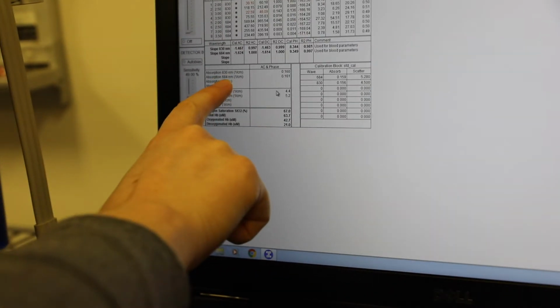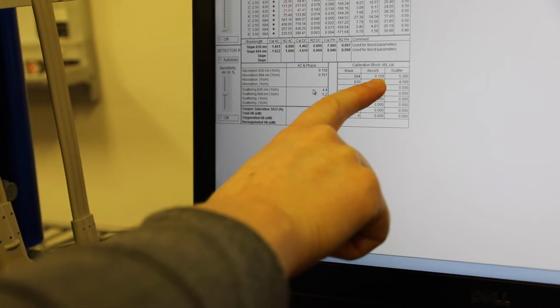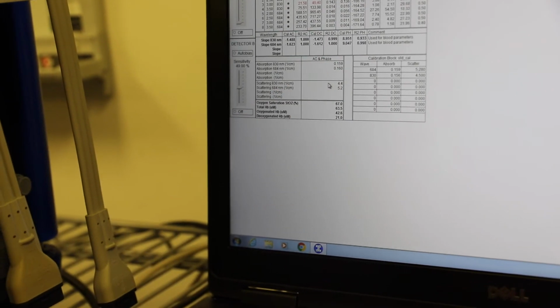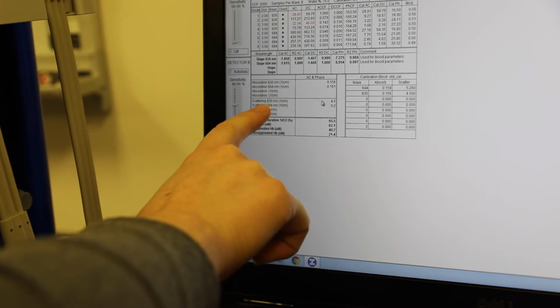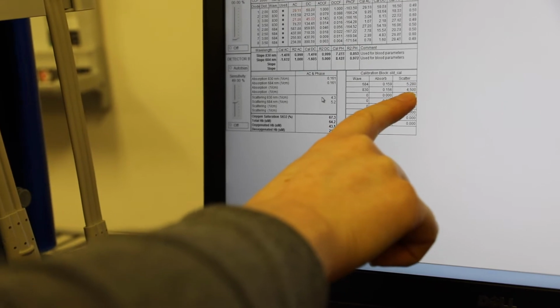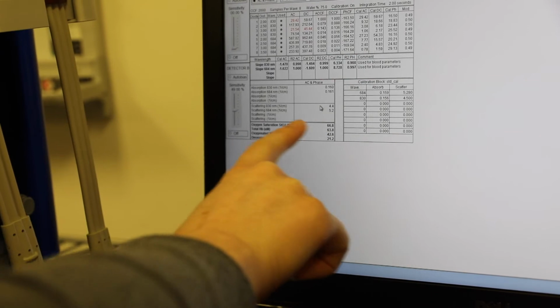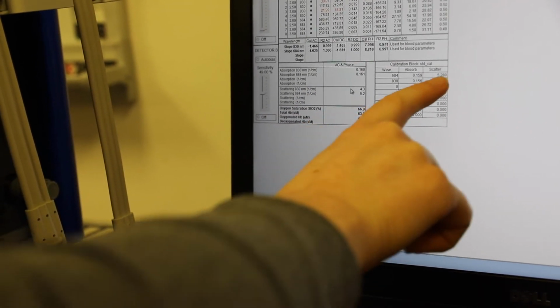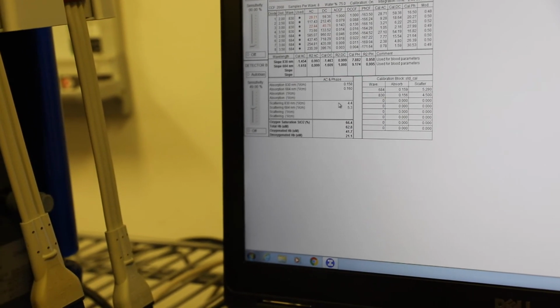Then we want to check the absorption for the 684 wave, which should be about 0.159, which again is pretty close. It's a little high, but it's pretty close, so that should be good. We then also want to check the scattering numbers. So for the scattering for 830, if we come over here, it should be 4.5, and it's right around there. And then the scattering for 684 is measuring at 5.2, and it should be about 5.28. So it's really close. So we know that the calibration is good.